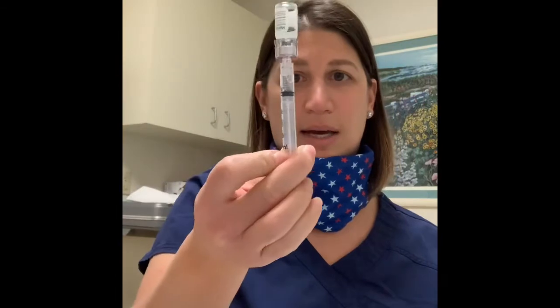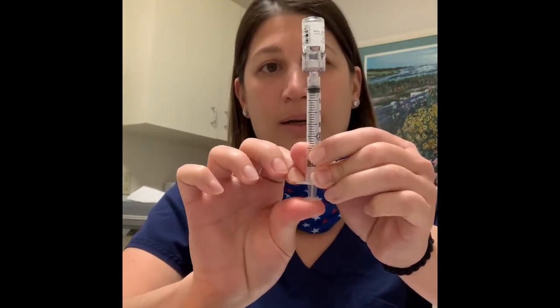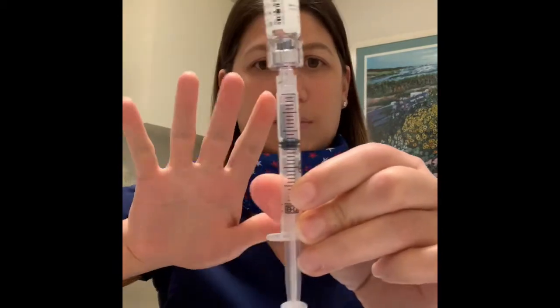It mixes fairly quickly and will be clear, just like water. Turn it upside down — if there's any air in the syringe, push all of that air in, then pull everything out until you have your air line. You'll have a chunk of air at the top; that's perfectly fine.